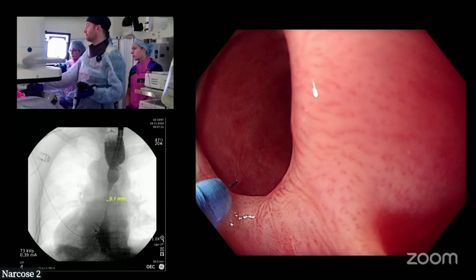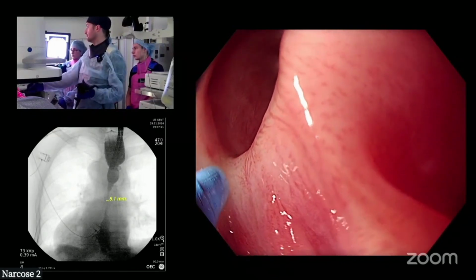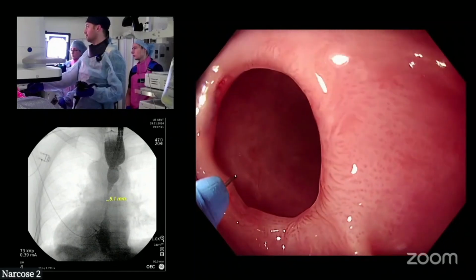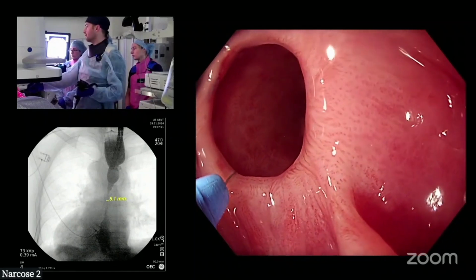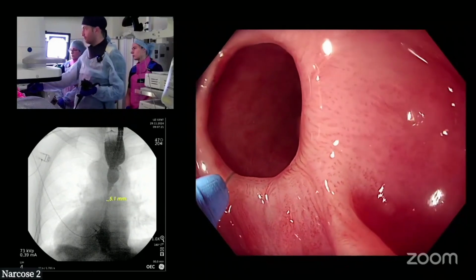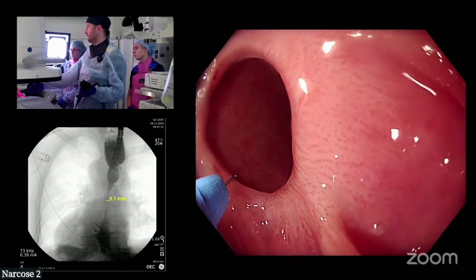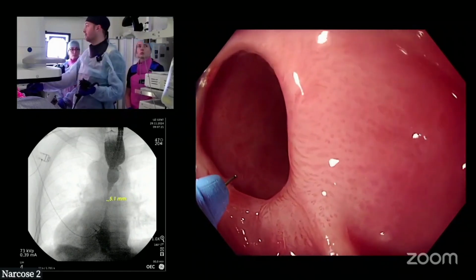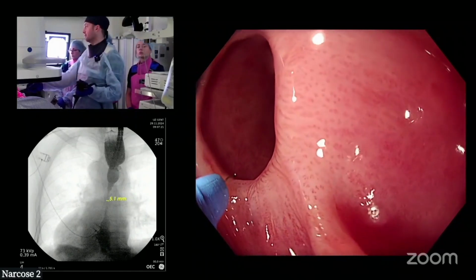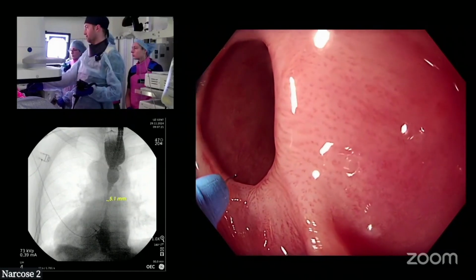What you absolutely cannot be is totally compressed in like this, right? If you're in like this, you're gonna make a hole. You need to have all the control on the up, down, and you need to be just sitting on the surface. If you're sitting down, then you're going to really cause a major problem because this thing is just gonna cut right down. We want Endocut I, effect 1, so essentially the papillotomy setting, and this is a papillotomy knife for doing pre-cut, I think.